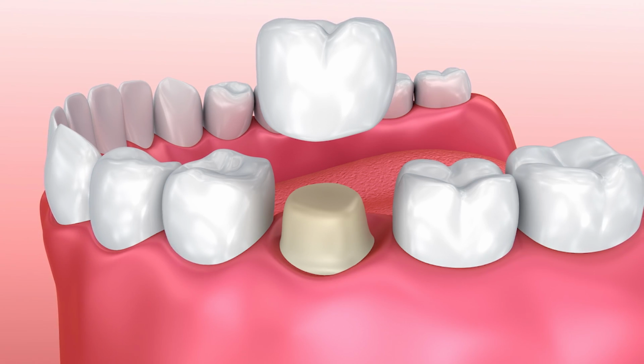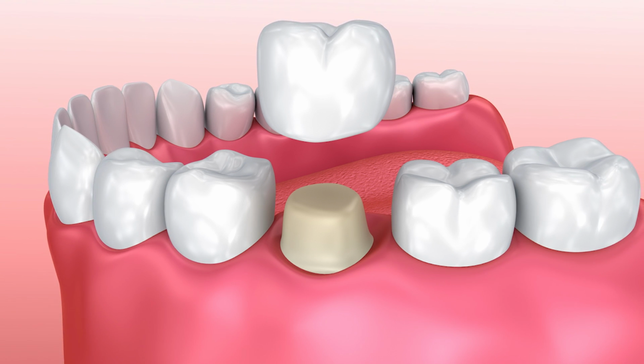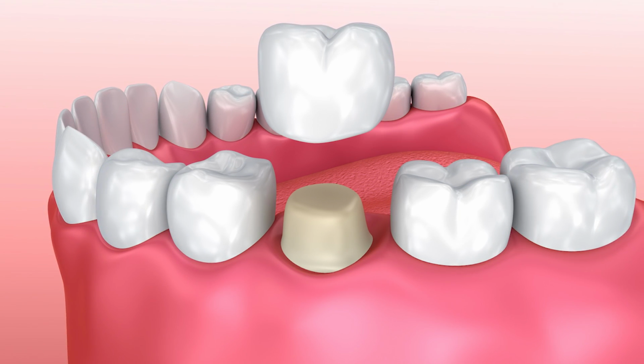the back teeth, because when you do a root canal, you're not only killing the nerve supply, you're also killing the blood supply. And when that tooth has no more blood supply, it can get a lot more brittle and easier to break. A crown is basically this ceramic cap that goes 360 degrees around the tooth to protect it.